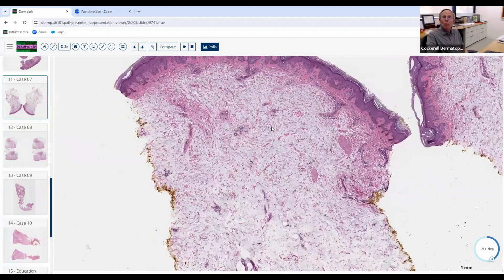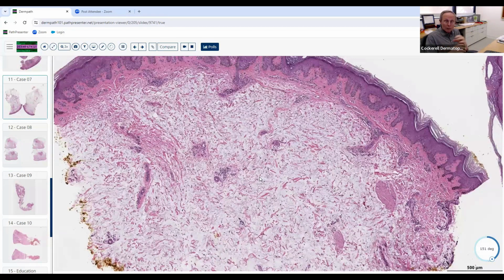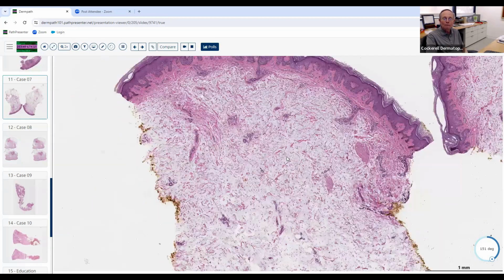Now, what about scleromyxedema? Is there a variant of scleromyxedema where you can get pretty significant quantities of mucin like this? There is a type that you can see in that situation. Is it the lichen scleromyxedema? Good. It's never a bad idea to at least give it a guess. That's a try, but it's actually the papular mucinosis form. If you biopsy those papules, sometimes you'll see the whole dermis is replaced by mucin with the fibroblasts. So you can see it there.